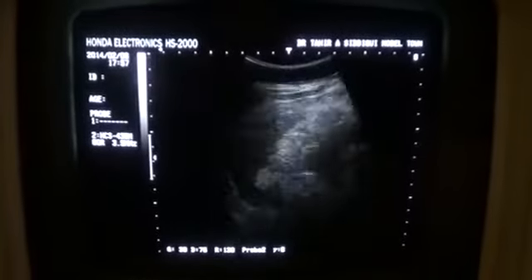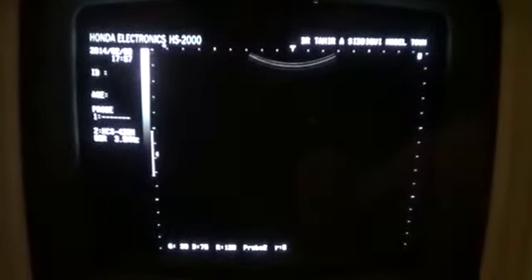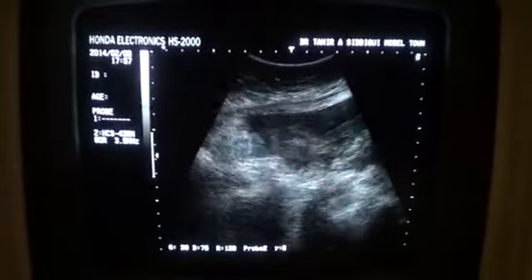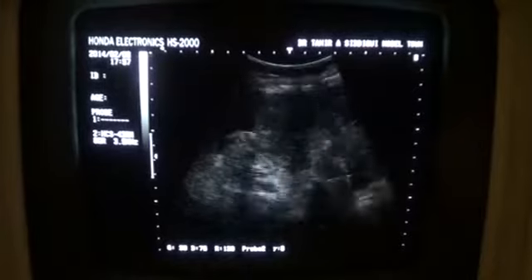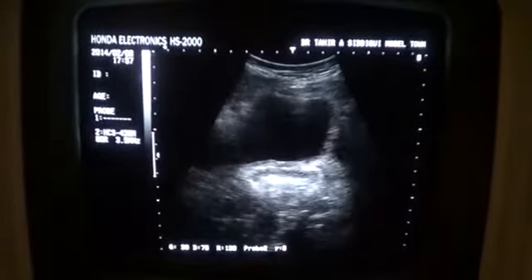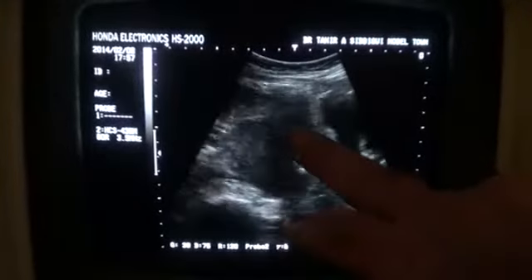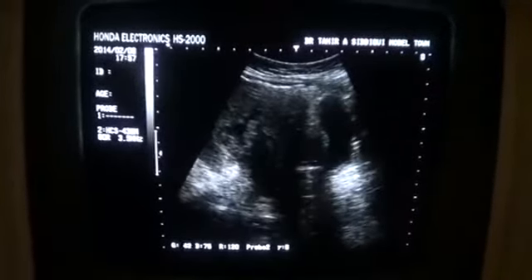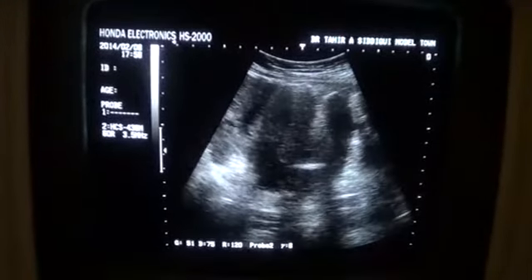Now, when I come further down, I see a solid area. This is the solid area which I am seeing. This being the urinary bladder. This is the urinary bladder in longitudinal section, this area, and now the longitudinal section of the urinary bladder. This width.